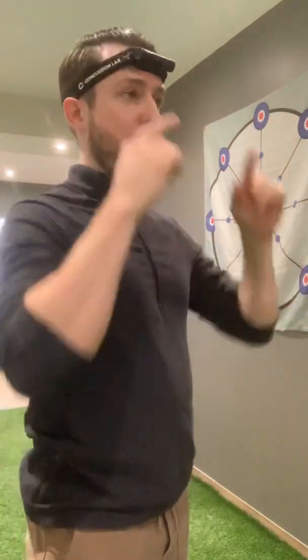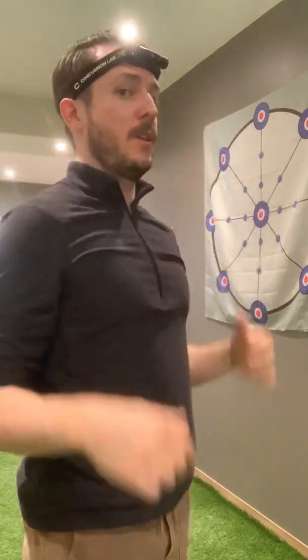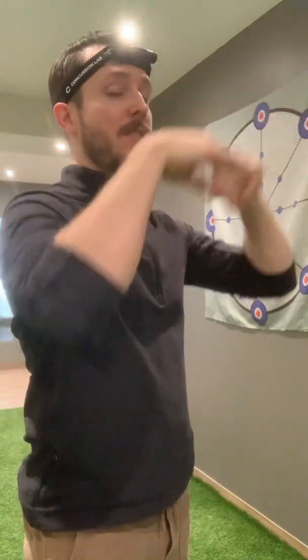For cervical proprioception work, we'll be mostly working with our head laser. The first thing you want to do is make sure that you have it right in the middle of your forehead, focusing on having the laser right in the middle of the target with your head in a nice neutral posture. Make sure you're adjusting it vertically so that you don't have to hold your head up or down to have it centered.